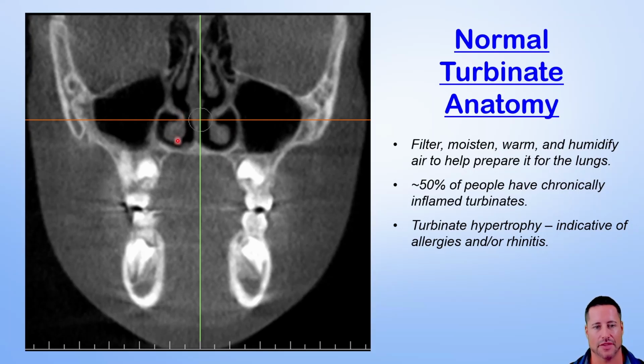I explained it to the parents and the patients, so it's a really easy way for them to understand that, because where there's gray or white, air can't go. So it's just a really easy way to explain it so people can understand it. So you want to see, obviously, sinuses that are symmetrical, even, appropriate size, and turbinates that aren't heavily inflamed, and we're going to go through examples of when this isn't the case.